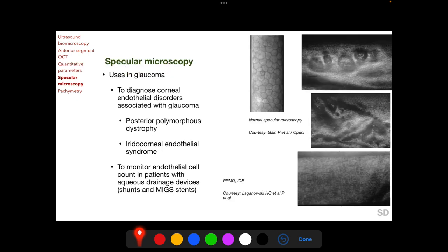Specular microscopy is used for imaging the corneal endothelium. Uses in glaucoma include diagnosis of corneal endothelial disorders associated with glaucoma, such as posterior polymorphous dystrophy and iridocorneal endothelial (ICE) syndrome. A specular photomicrograph of normal corneal endothelium is shown, and two photomicrographs show the appearance in posterior polymorphous dystrophy, demonstrating vesicles and bands in the corneal endothelium visible clinically on slit lamp.